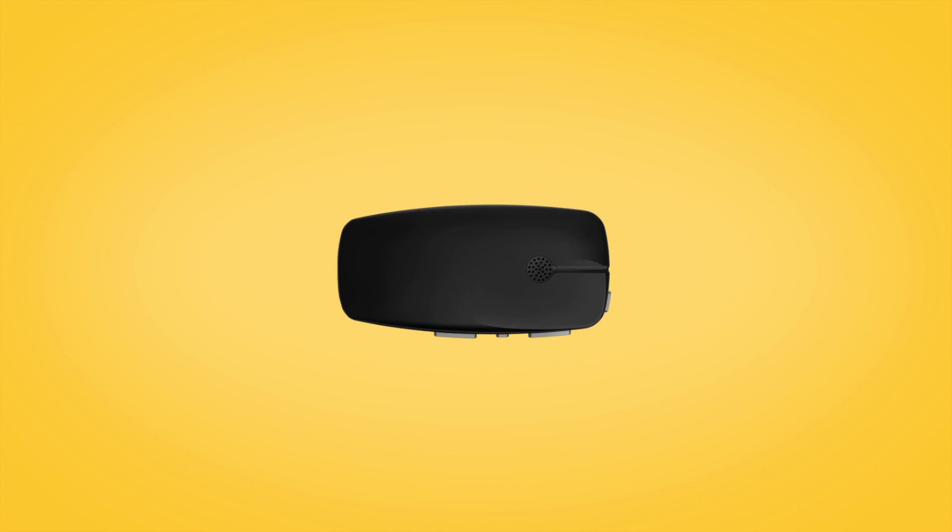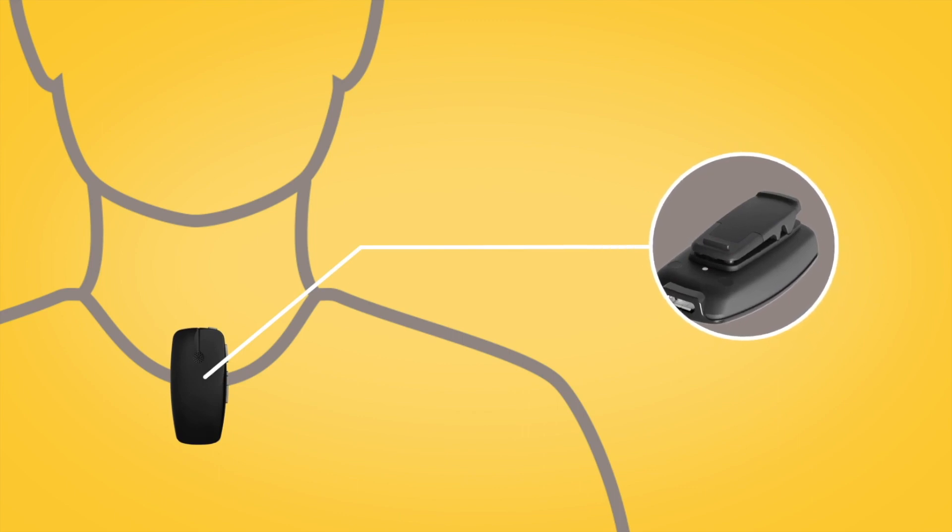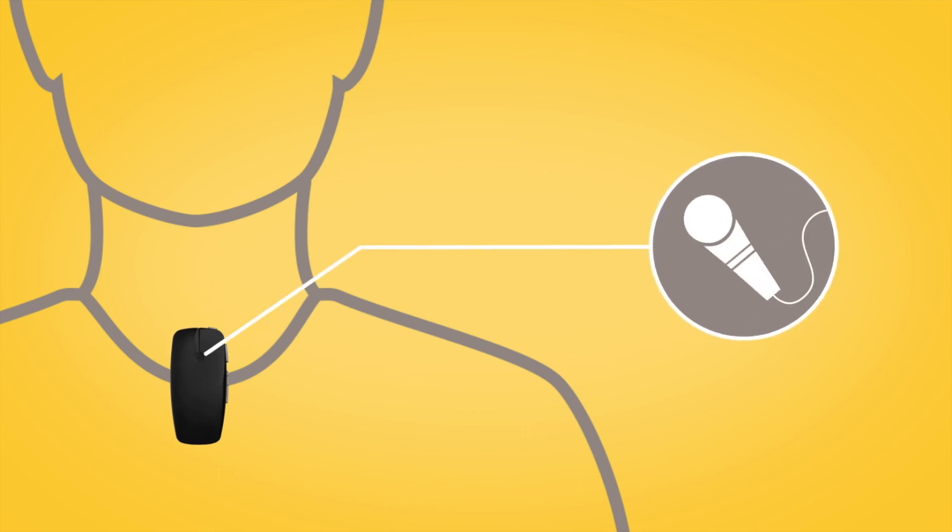When you are ready to use your Mini Microphone, give it to the person you want to listen to and ask them to position it close to their mouth by placing it on their clothing using the clip on the back. The Mini Microphone has directional microphones, so must be positioned vertically to point at the speaker's mouth.